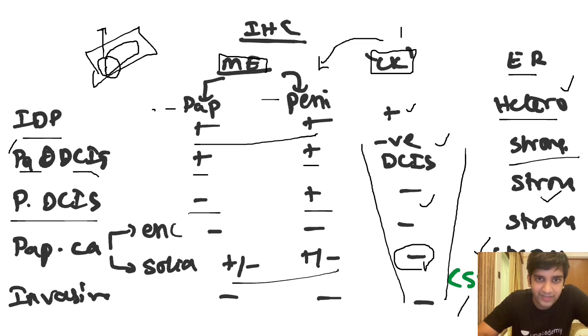Actually, there's something called S written here, right? My video's hiding that. So these solid encapsulated papillary carcinomas generally will have a neuroendocrine differentiation. So for neuroendocrine differentiation, do a synaptophysin if you doubt, or even otherwise do a synaptophysin. I am not having the marker profile for our case. I didn't have the slides. I had only the histomorphology with me. But if you have a solid papillary carcinoma, I want you to do one synaptophysin.